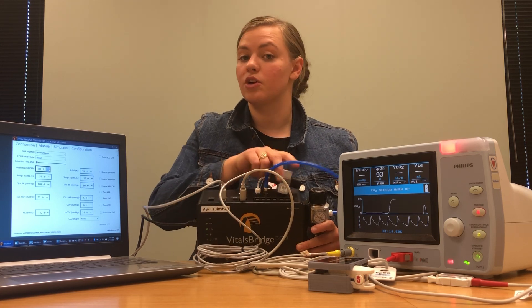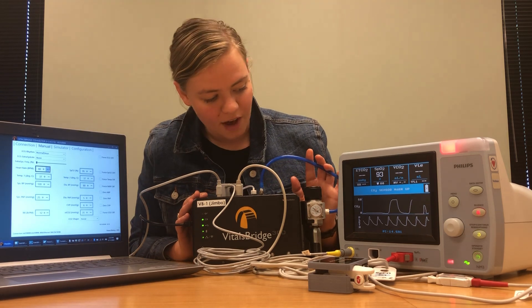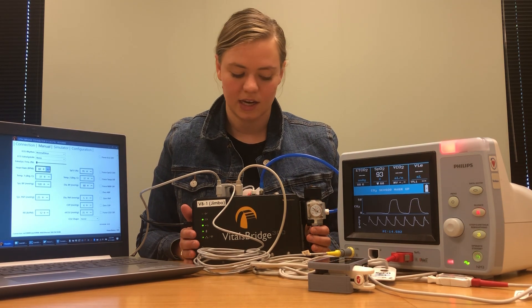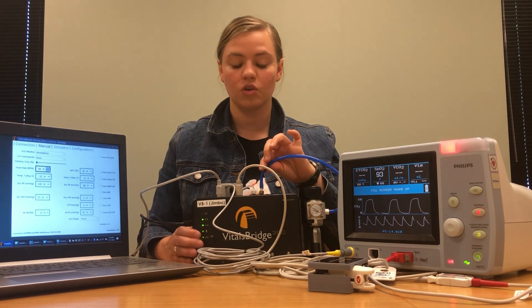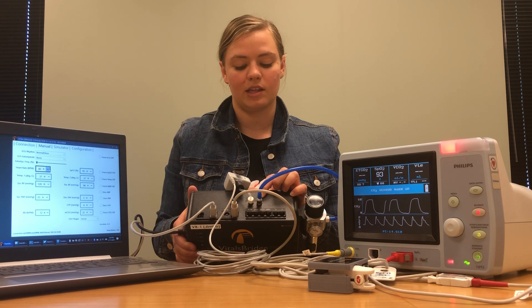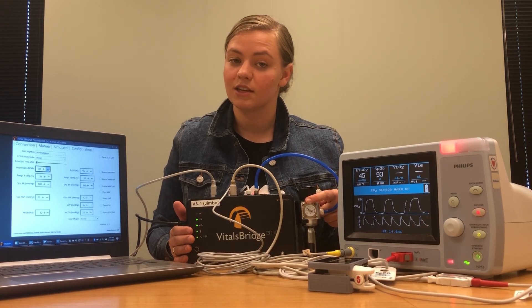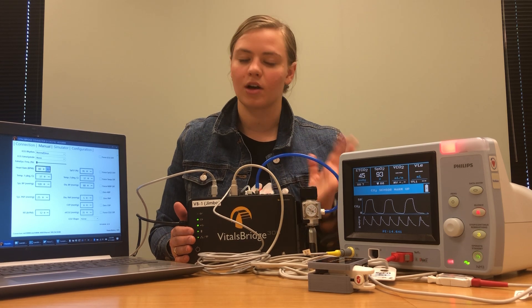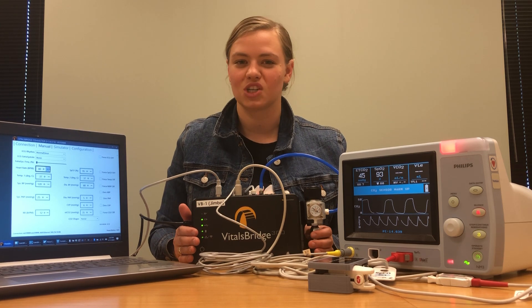In order to get a CO2 reading, you're also going to need a carbon dioxide source. I already have one set up. This carbon dioxide source is a VitalsBridge carbon dioxide canister. I connected it via this tube to the part that says CO2 in, and then I turned on the regulator to be between 15 and 20 PSI. If you want to use a wall CO2 source, you're welcome to do that as well — just talk to your facilities manager and make sure everything's at the proper pressure.